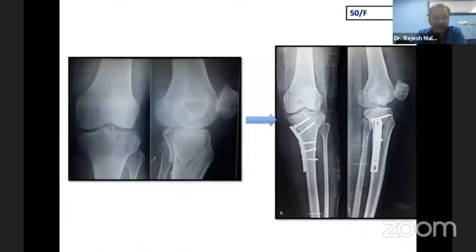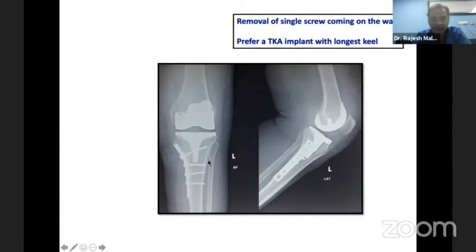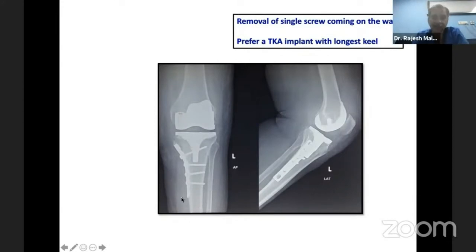This is a 50-year-old female who had a tibial fracture, was fixed, then developed osteoarthritis and needed knee replacement. All I did was remove one screw that was coming in the way. I could actually bypass this screw during keel preparation, and sometimes to avoid a stress riser I use a tibial implant with a slightly longer keel. The other advantage of leaving the implant is that if I remove everything and a periprosthetic fracture occurs at the stem tip, it becomes a Type B. But if I leave the plate and a fracture occurs there, it is actually Type C and I can do internal fixation without any problems. I don't see any harm at all in leaving the implant in place.